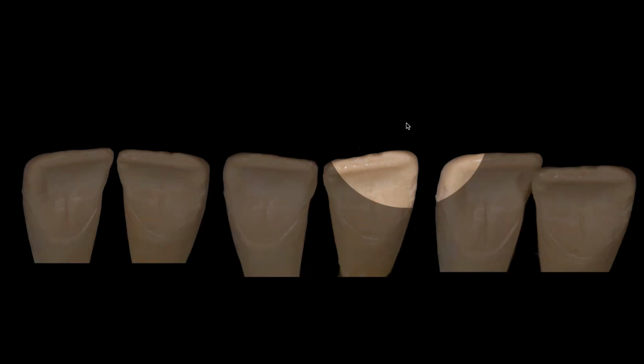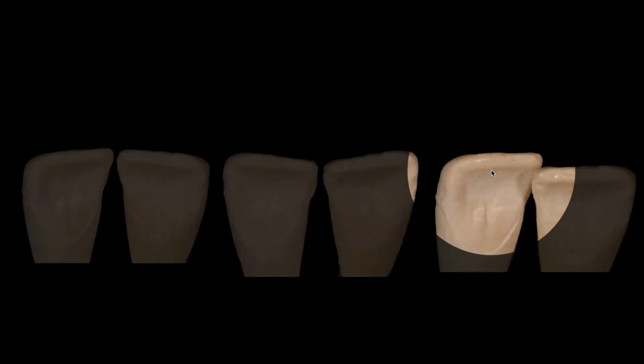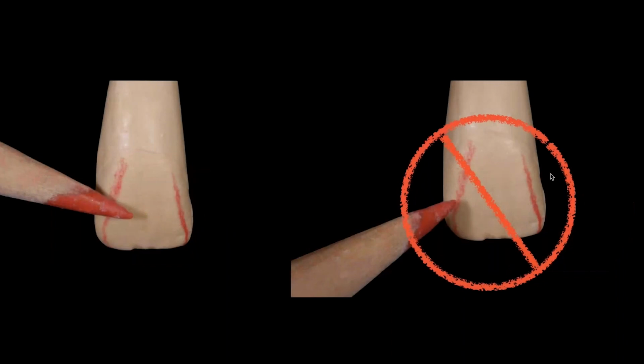And when we overlap, it's a whole different ball game, right? Because I always laugh and say that the Europeans were so much better with overlaps than I think we as Americans were, because they did so many more of them. And we have a tendency to not think of the lingual morphology or the lingual form. So when we're trying to overlap a tooth, we just kind of move it out there and put it over. But it doesn't really work that way, right? In order for a tooth to overlap, it's all about the lingual morphology and making sure that the lingual contour is proper. Otherwise, it'll never look right when it lays over or sticks out or protrudes out a little bit from the adjacent tooth.